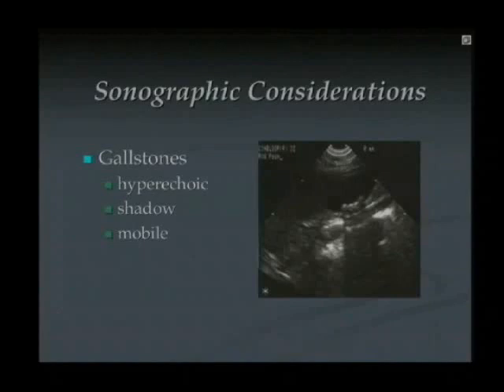Now, stones usually are mobile, so if you were to turn the patient and rescan again, it would move slightly. Or, obviously, if it's an inflamed gallbladder, a stone stuck at a gallbladder neck, it wouldn't move. But they definitely need to be sitting in the gallbladder, and they need to cast a shadow, because there's a lot of mimics in the right upper quadrant.